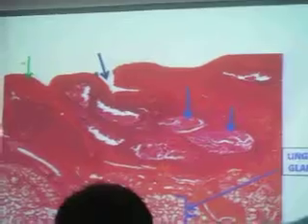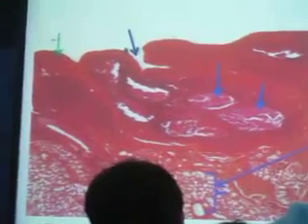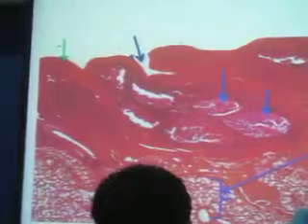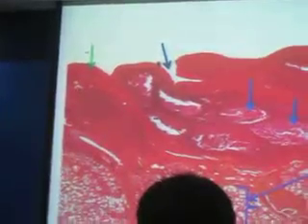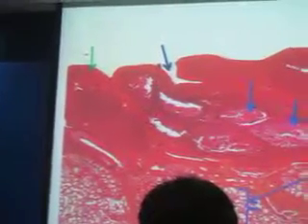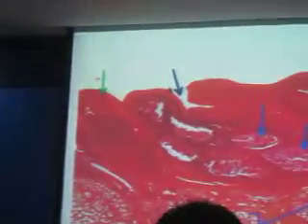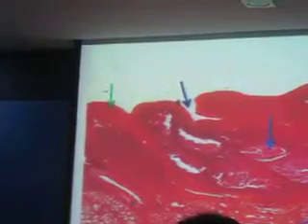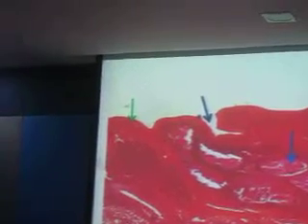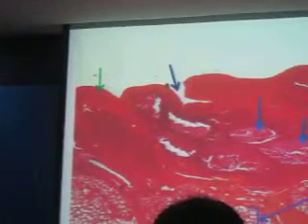The other type of tonsil is your pharyngeal tonsil, which we don't have. We don't have slide of pharyngeal tonsil. But characteristically, you will know that it is pharyngeal tonsil if the lining epithelium is that of respiratory epithelium, which is pseudostratified columnar ciliated epithelium with goblet cell. Because it is found in the nasopharynx, which is respiratory tract. Because your pharyngeal tonsil is located in posterior superior part of your nasopharynx. You only have one of them. So hence it is lined by respiratory epithelium.